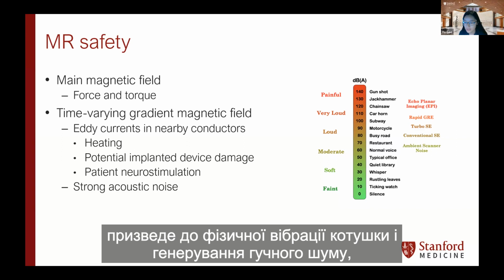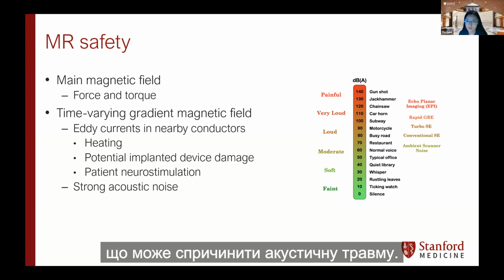Lastly, the switching of the gradient coil current will also cause the coil to physically vibrate and generate loud noise that may cause acoustic injury. So hearing protection is very important.